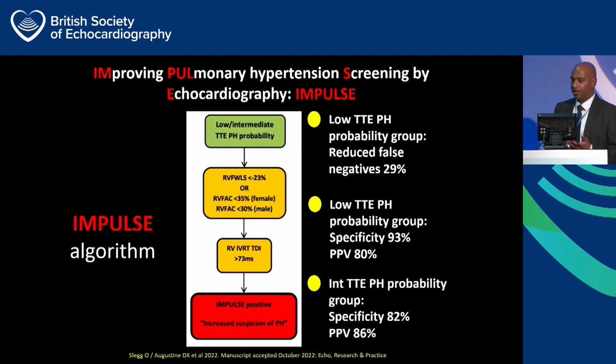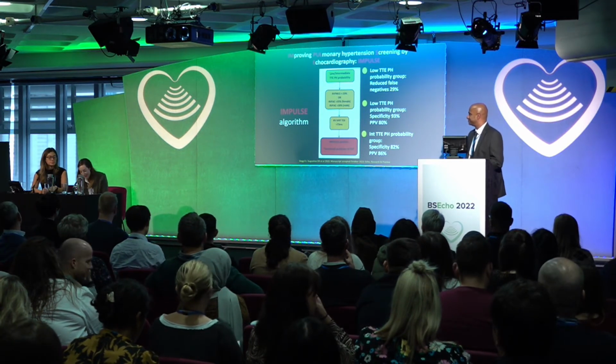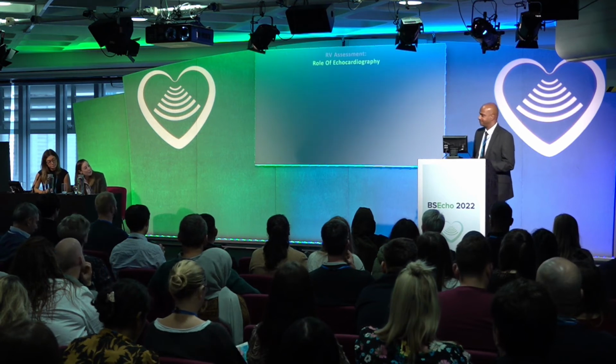So I think it's encouraging early work. More needs to be done, and I'm really excited about the prospective work. You need standardization. It's hard to do things retrospectively when you consider differences in frame rates, acquisition, and angles of acquisition. You need an RV focus view, etc. We'll be able to iron all of this out in the prospective work over the next 3 years. Brilliant, thank you. There's a lot to consider in terms of RV function, but you're making great headway in teaching us all about what more we can do.